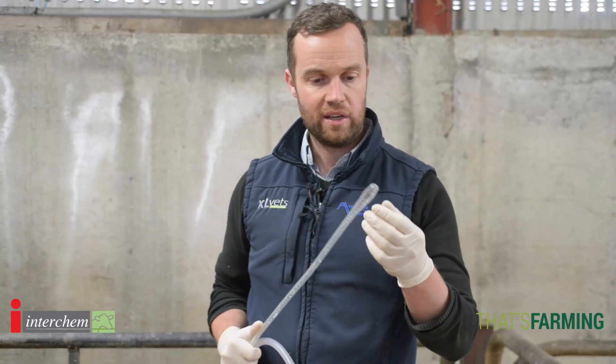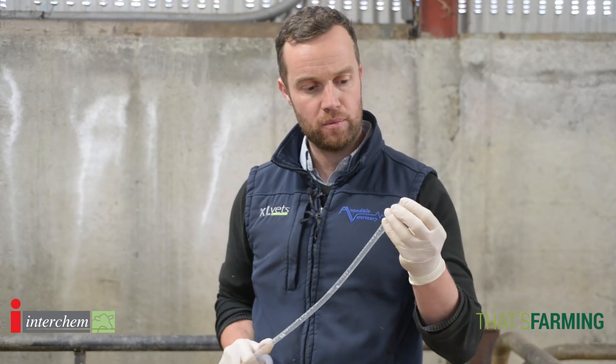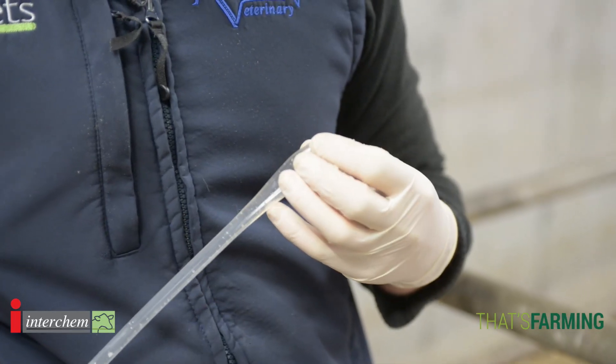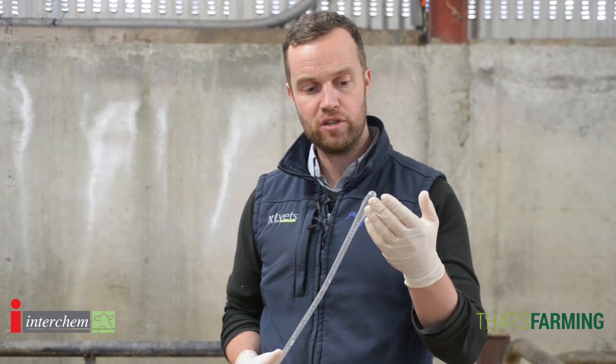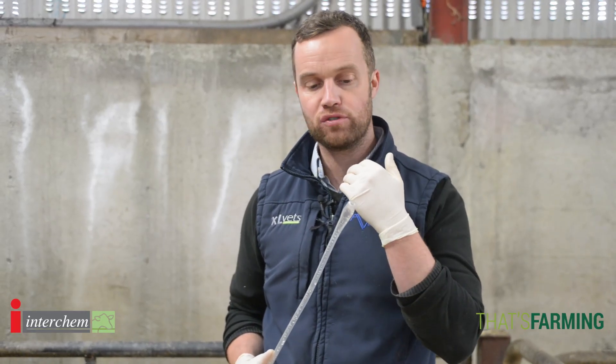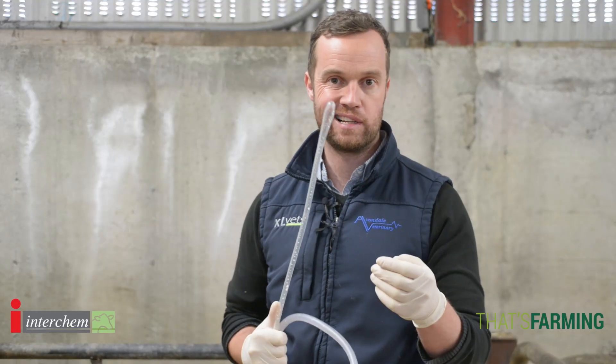One important thing I'd like to emphasize is the maintenance of the stomach tube. The bulb at the top of the stomach tube is rounded to make it easy to swallow and it's also quite smooth — it's something you don't want to get damaged because it can damage the back of the calf's throat. Just check that your stomach tube, like any machine or implement on the farm, is clean and working well.